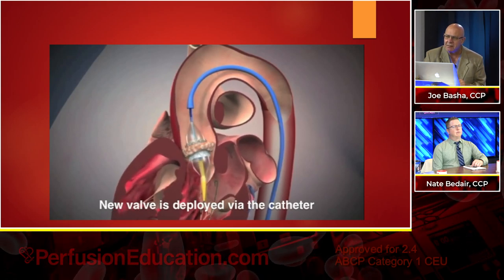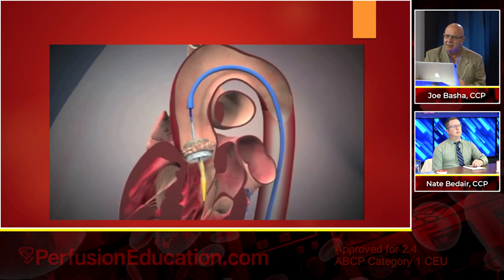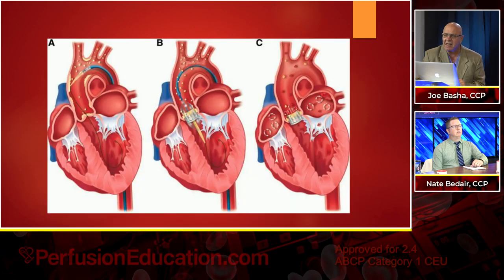It's going to happen. There it goes. Do the rapid pacing and deploy it. Look at how beautiful that looks. Okay. So what's the reality?